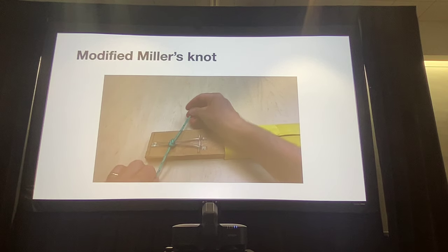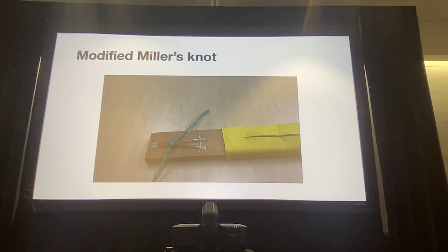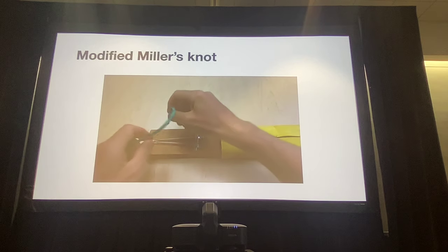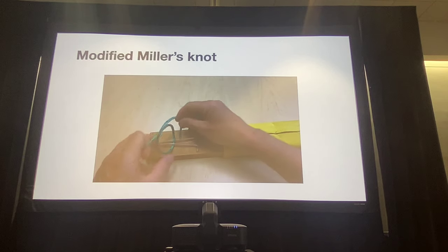I do transfixation, so I'll place a suture between the vessels, let's say, or between the fascia around the vessels and the vessel itself. Suture on one side, and then wrap it around, suture on the other, and then cut it. I switch my order over time, because I do both, but I'll do transfixation first. It's more secure, and then I'll do the circumferential as kind of a backup plan. For uterus, for example, I may just ligate the one artery on one side, ligate the other, and then do either a circumferential or a transfixation for the body. Depends how big the tissue is.